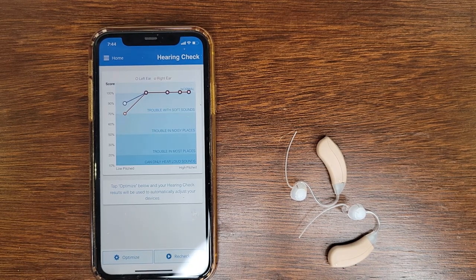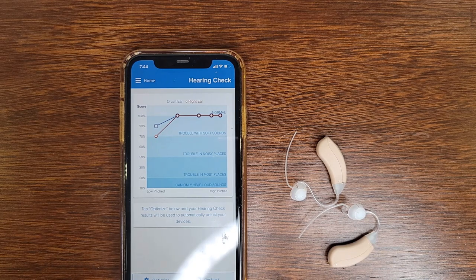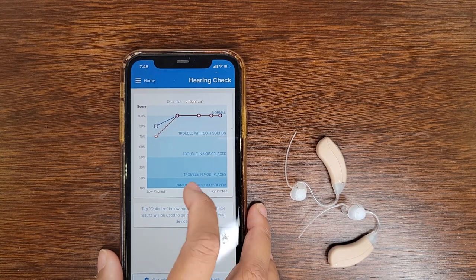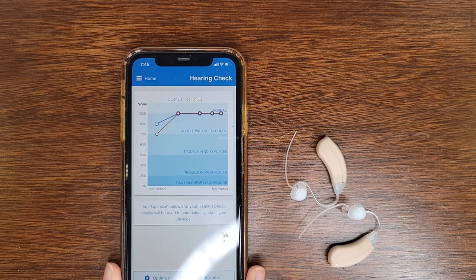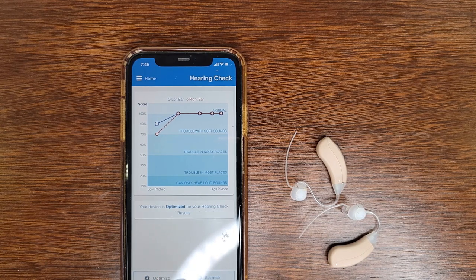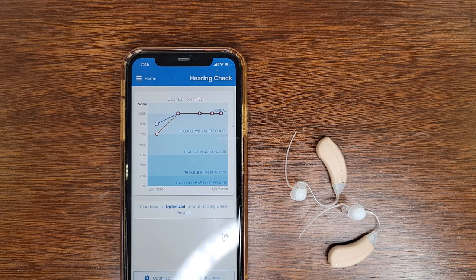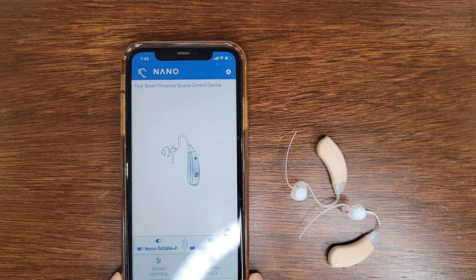and let's see our results. So it will show you on the graph the sound frequencies you might have trouble with. So it will rate it based on this chart, and then it will adjust accordingly. So let's click optimize. Once you click optimize, it will optimize the hearing chart levels based on your results. So it says it's optimized. So let's go back to the home settings.